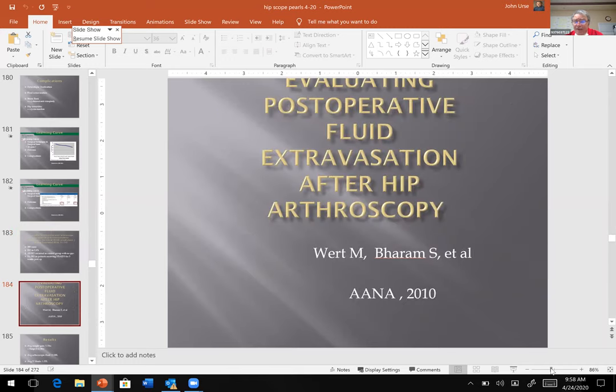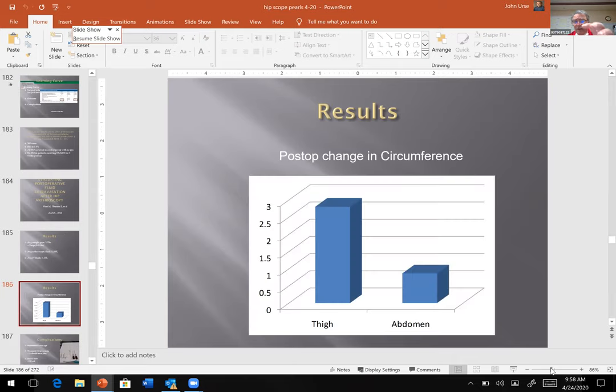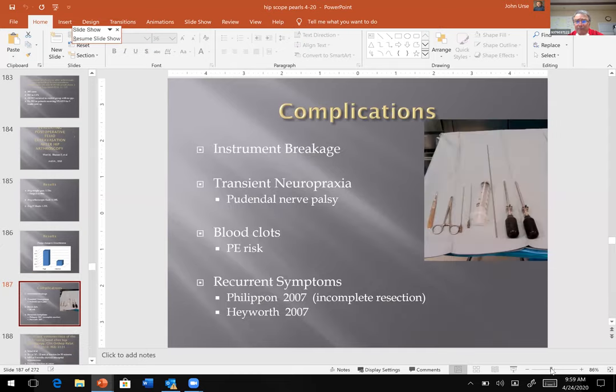Fluid extravasation can be catastrophic. It can be life-threatening. The average weight gain after a hip scope is almost 6 pounds. It's actually 7 for a shoulder. But there's two places you'll see fluid accumulation: in the thigh, which accommodates a lot of fluid, but the place that doesn't accommodate is the retroperitoneal space. If you start to open the capsule, either an iliopsoas release or a significant capsulotomy, you can get fluid extravasation in the retroperitoneal space that can affect vital signs and cause abdominal distension. You definitely lower your pump pressure on that. I always tell my anesthesia people that part of the surgery starting where I'm opening the capsule, my retroperitoneal space gets fluid only at the end of the case. If I'm doing an iliopsoas release, I do that last. And you can always, obviously, turn off your pump, turn them on their side, and give them fluid management. We don't want to break instruments.